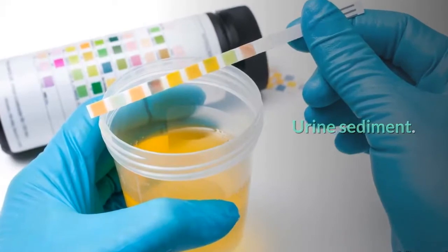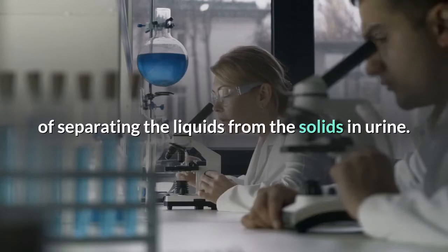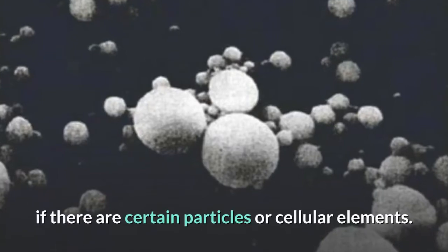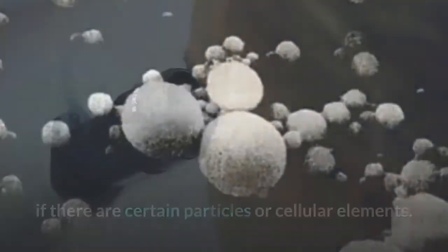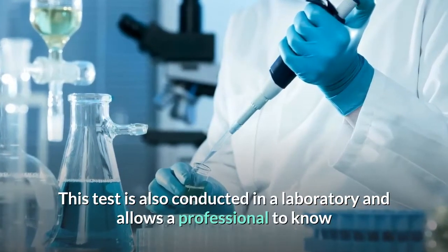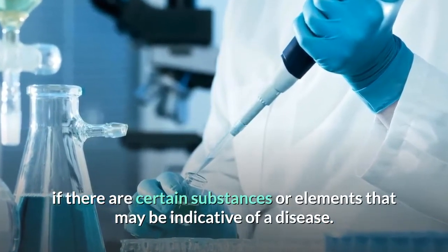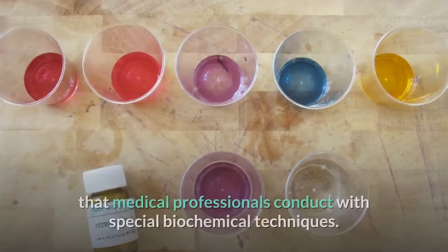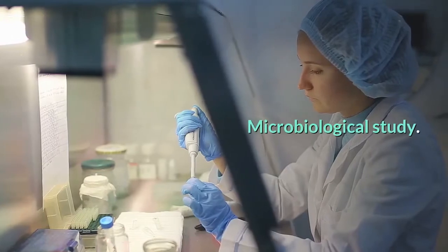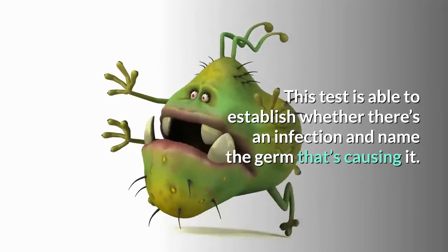Urine sediment. This is conducted in a laboratory and consists, firstly, of separating the liquids from the solids in urine. The latter are then examined under the microscope to determine if there are certain particles or cellular elements. Biochemical study. This test is also conducted in a laboratory and allows a professional to know if there are certain substances or elements that may be indicative of a disease. It's a more exhaustive analysis that medical professionals conduct with special biochemical techniques. Microbiological study. This test is able to establish whether there's an infection and name the germ that's causing it.